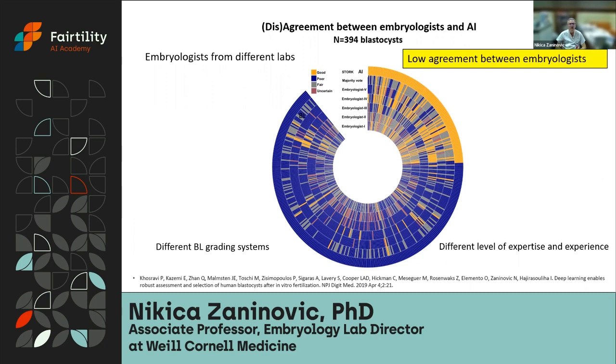disagreement among embryologists. And a couple of years ago, we looked at, let's say, AI models that are predicting high quality embryos in orange. And if we give the same images to 5 different embryologists all around the world, we see high diversity. This diversity among opinions is because not only are they from different labs, they have different grading systems in the laboratories, and also they have a different level of expertise. So this is the main problem in the laboratory. And you cannot really transfer information from one lab to another.